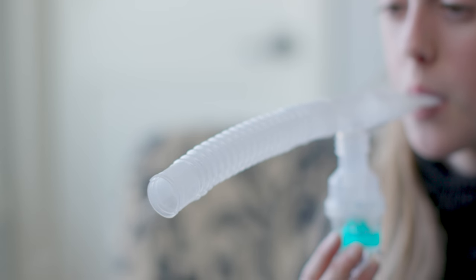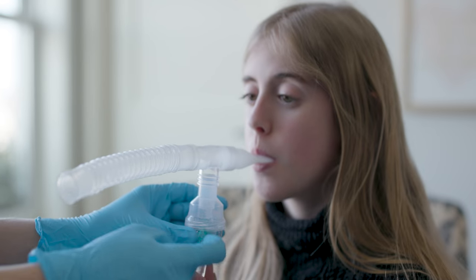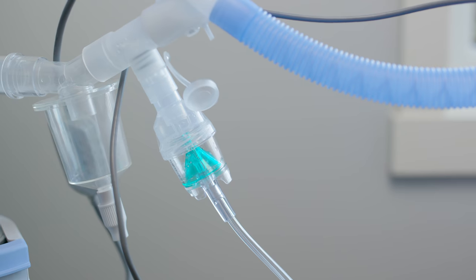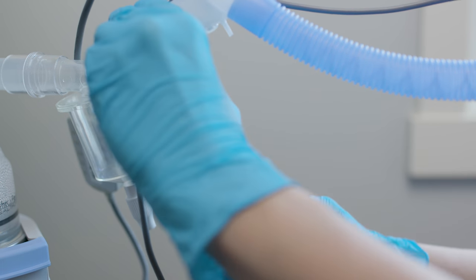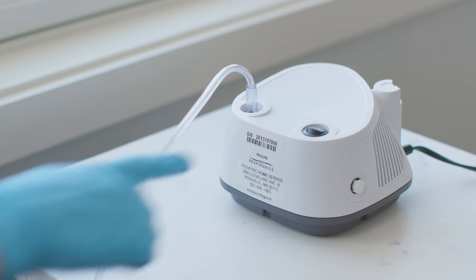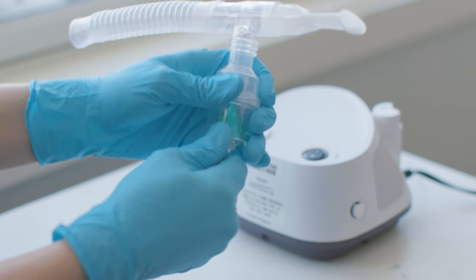The neb treatment is finished when no more mist comes out of the delivery device, even after tapping on the neb cup. There may still be some drops of medicine in the bottom of the cup. Remove the delivery device and neb cup from the patient or ventilator tubing circuit. Turn the neb machine off and disconnect the tubing from the neb cup.